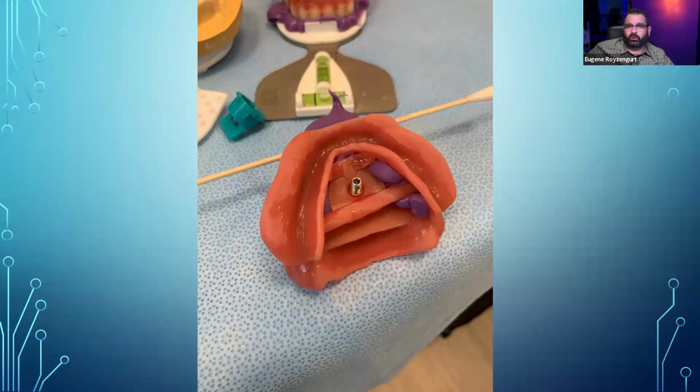You're like, "Oh, this thing is horrible. These teeth are too long. I'm biting more on one side than this side. I don't like the buccal corridors," things like that. So I don't think you can do really good dentures this way. A good denture requires time, guys.